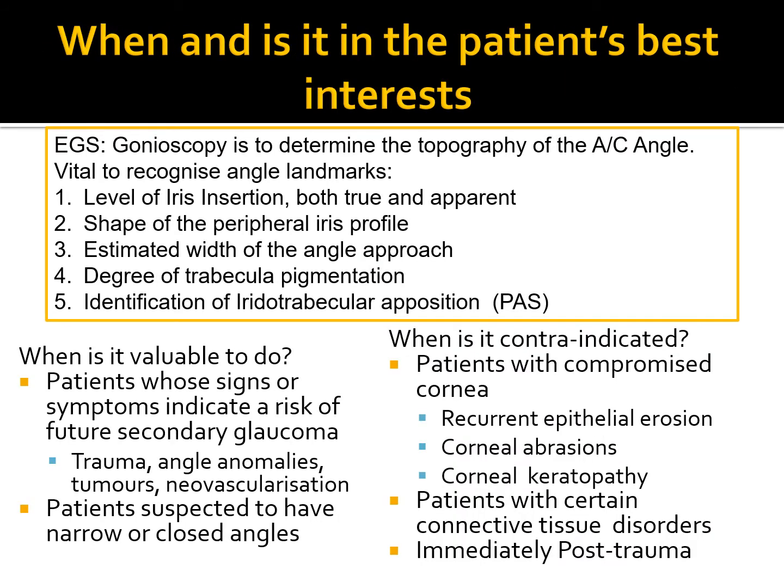So when is it in the patient's best interests to do gonioscopy? And I think that's the real point. It's got to be a point to the patient. Otherwise, you're doing something for no real reason. Is it going to change your referral from a community practice point of view? Is it going to change your management?